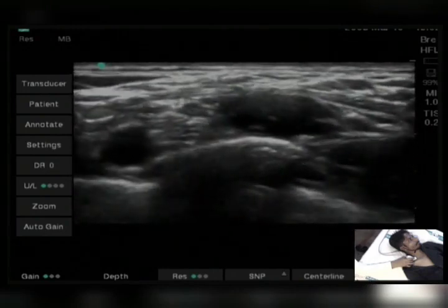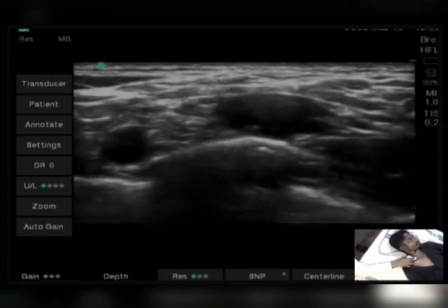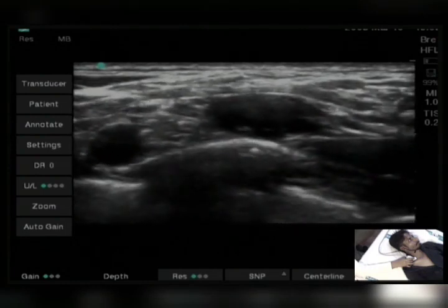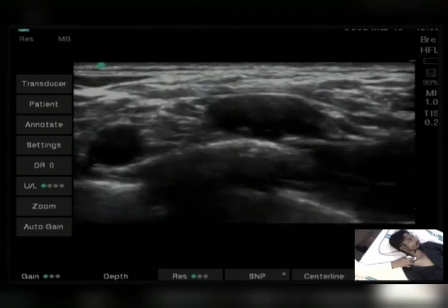So bilaterally, see, we can visualize the lung sliding sign. The lung is moving, the tissue is moving like this, so that is the sliding sign, and the hyperechoic rib is showing posterior acoustic shadow. So thereby you have to identify the rib and pleura.